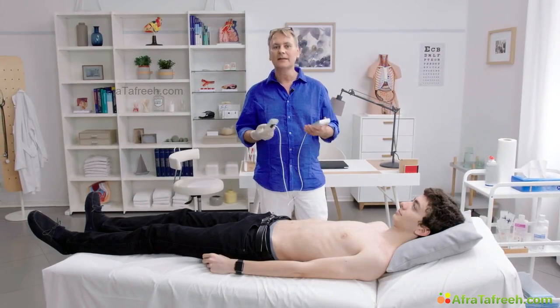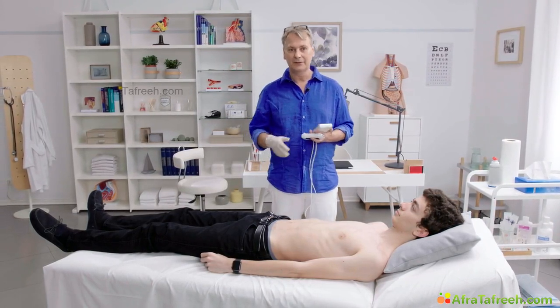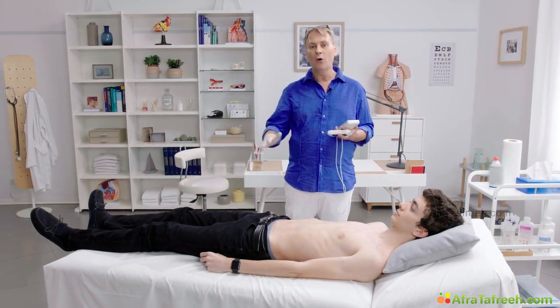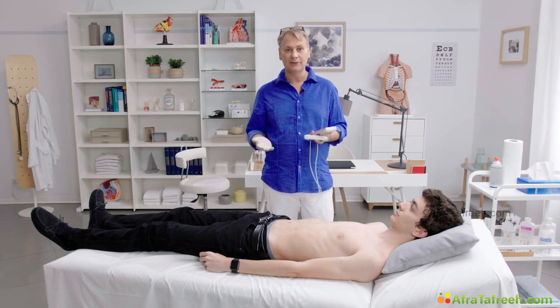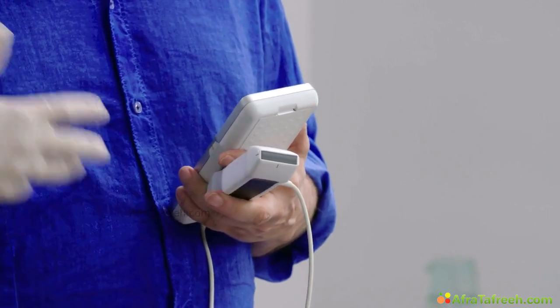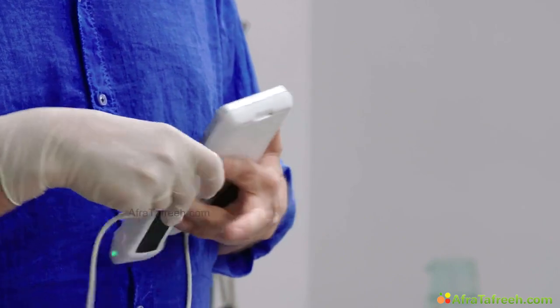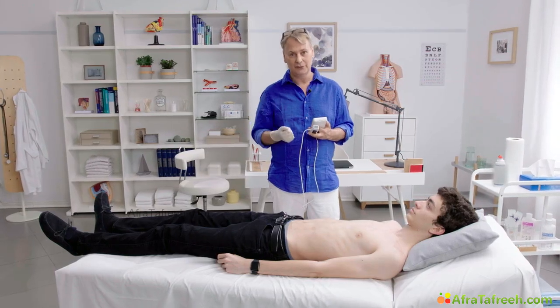Imaging the lung is actually quite simple, especially if you're only looking for a pleural effusion. You can image the patient both in a supine position or if he sits up. Even in a half-reclined position, it's possible to look at the lungs. I will first focus on the linear probe and show you what we see here. And then we'll use the sector probe, which is, in my view, better to image a pleural effusion.